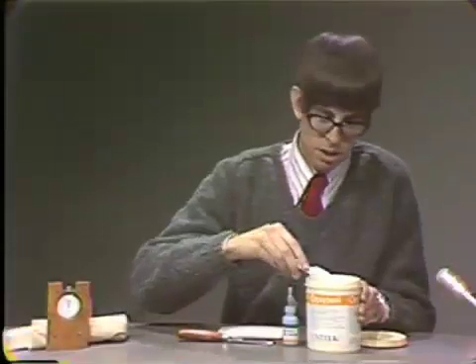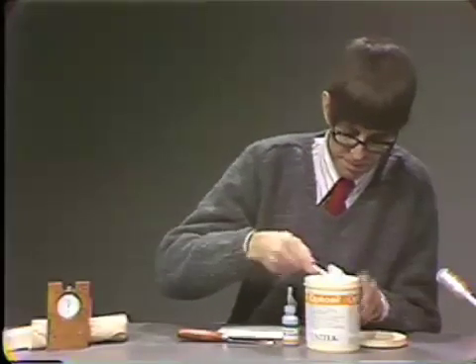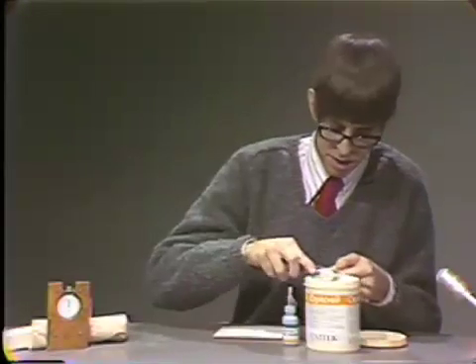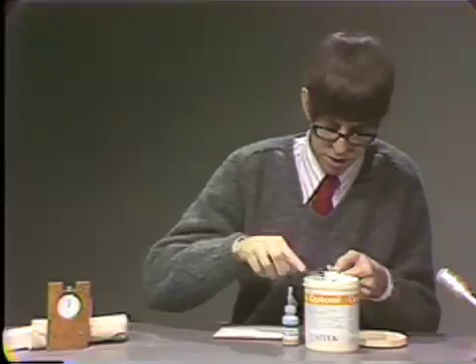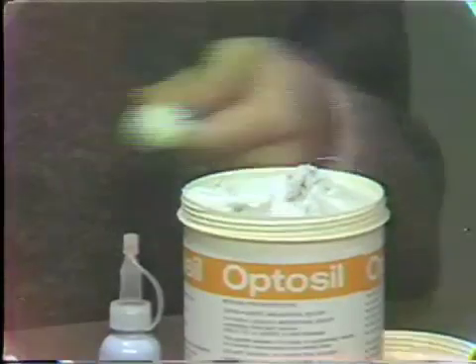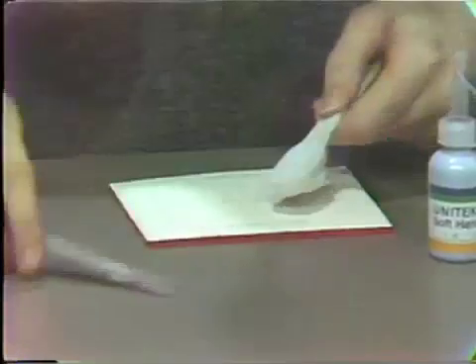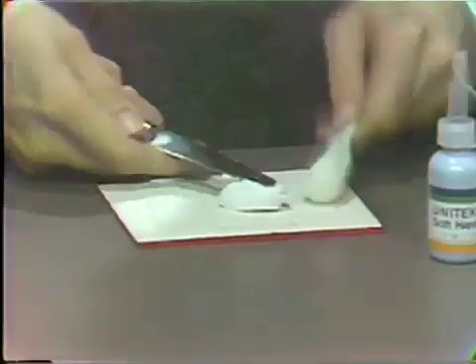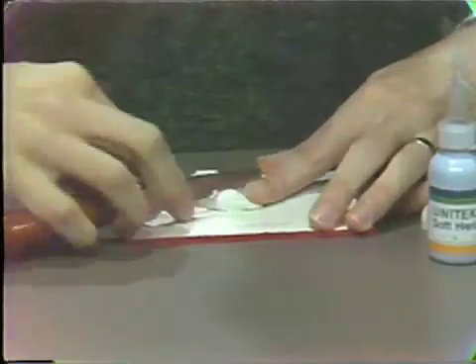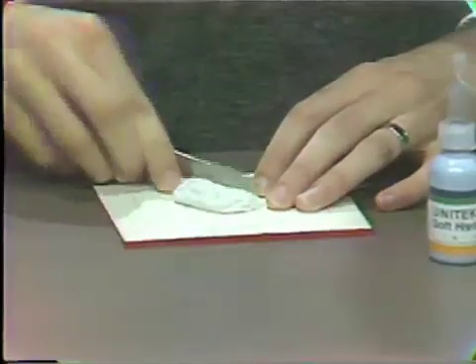To dispense the putty, we place the measuring cup into the material and get a level measuring cup full of the base material. This can then be dispensed onto the mixing pad and should be crosshatched to receive the liquid catalyst. As you can see, this has quite a stiff consistency.